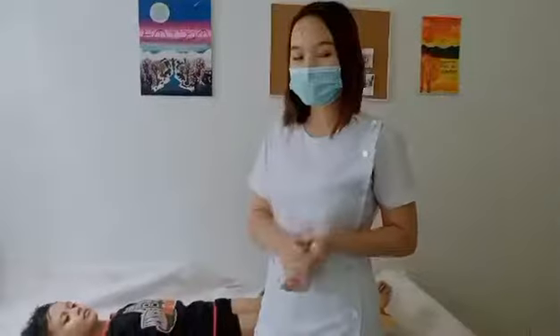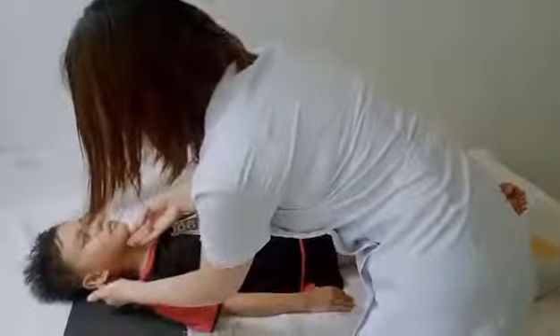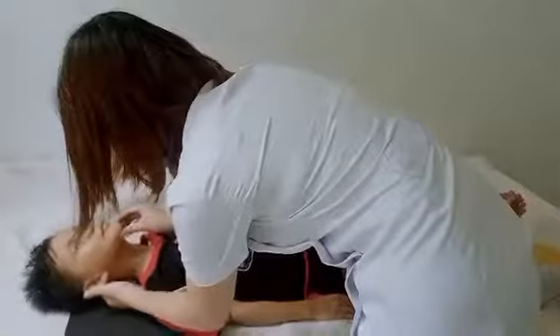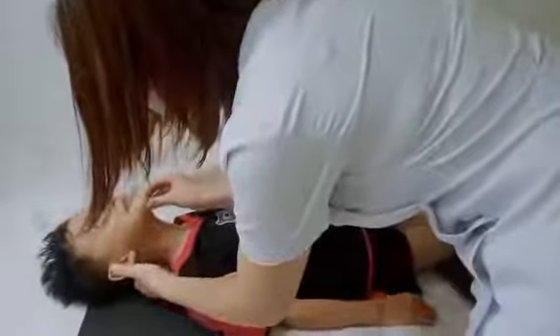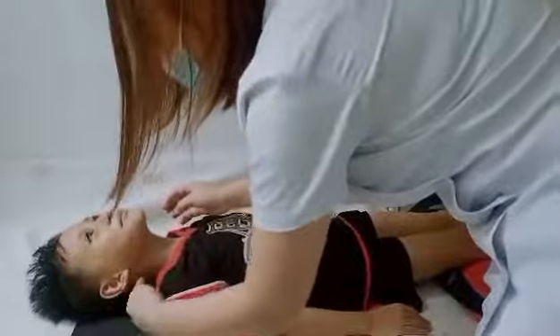So, position of part. So, imagine that the IR is placed inside the bucky tray. And then, center the IR to the level of the mastoid process. And then, extend the chin until the chin and the tip of the mastoid process are vertical.